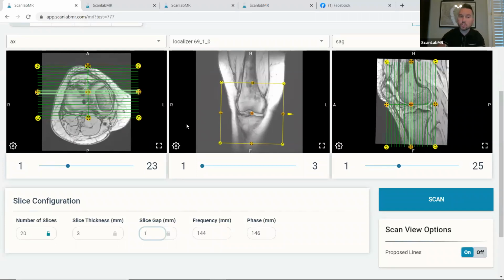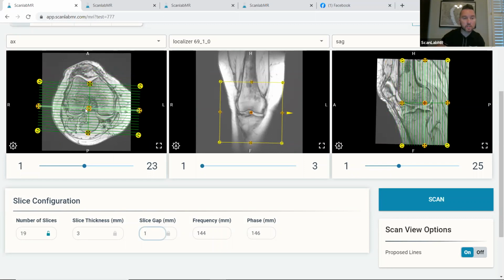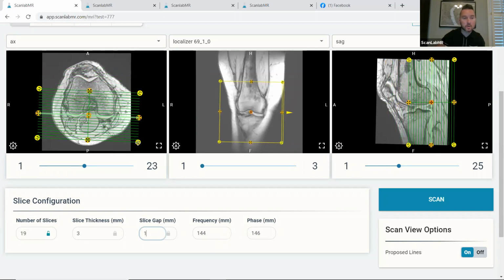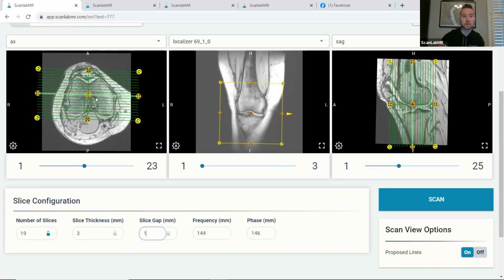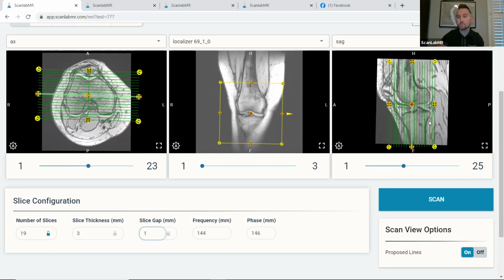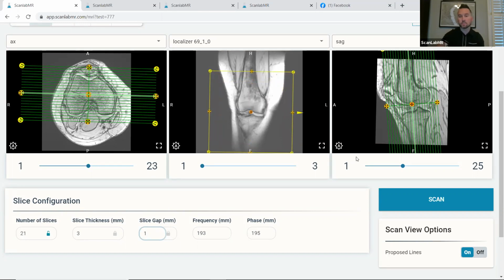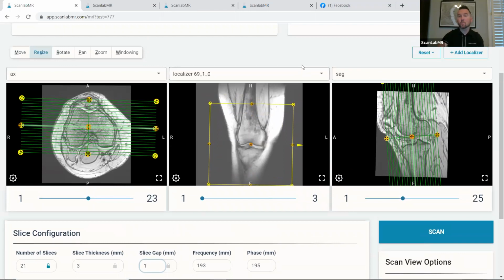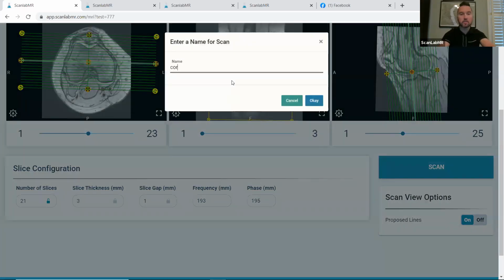And now, just like in normal MRI, I have a really nice axial to say, well, let's take maybe my medial line here. So we wanted just one line to be the focus. Is that going to be perpendicular to my condyle or parallel to my condyle? There we go. And I can add that criteria in. Let's make this a little too big. Let's say I'd like to hopefully get a little bit of the other knee. 2 for 1. So when we're finished with this, you'll notice that I'll hit scan and we can get our coronal back. Okay.